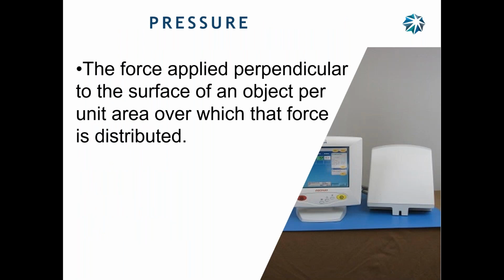Pressure. What's pressure? This is my favorite subject. What's pressure? Is this pressure? Me pushing on the wall? If I bring a bulldozer in and push on the wall, is that pressure? Which has more pressure? Here, here, or the bulldozer? My finger has more pressure on it.